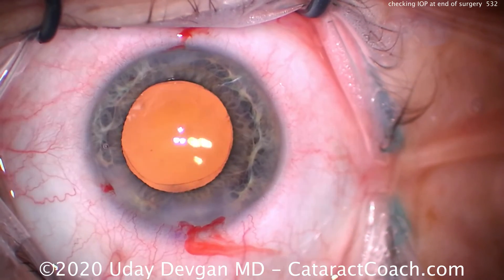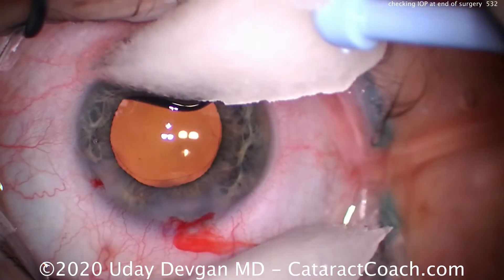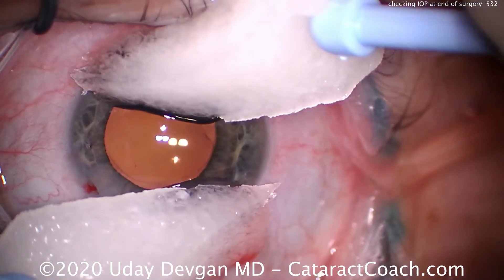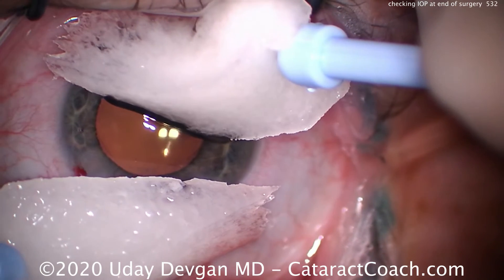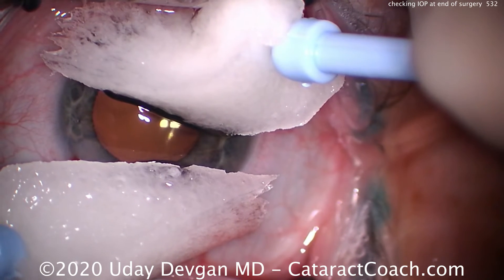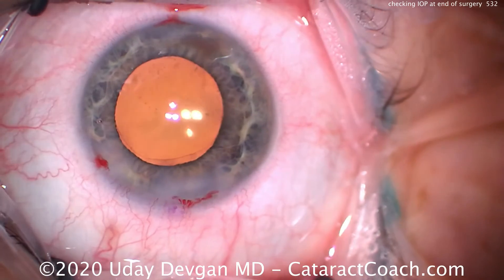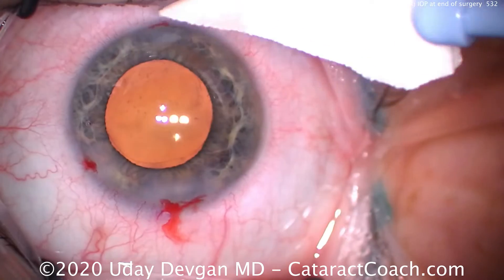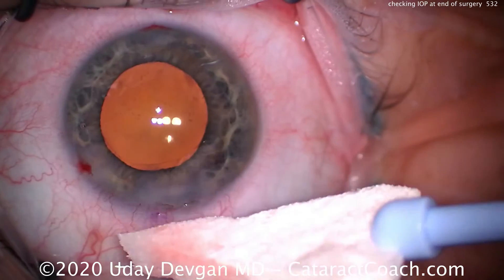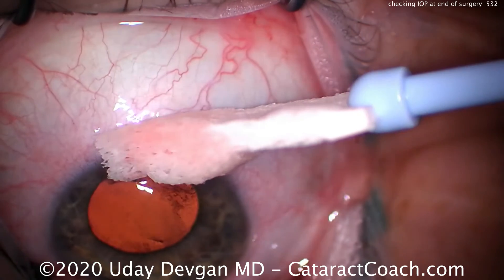Notice the incisions have a little bit of bleeding from them — that's how I like it. I like these incisions to slightly nick the limbal vessels; I think they seal better. In this patient I made two incisions to help address astigmatism, sitting superiorly — with-the-rule at about the 90-degree meridian. We're checking both incisions, superior and inferior, making sure they're sealed up. That looks good. We'll check the other one as well, making sure everything is sufficiently sealed.